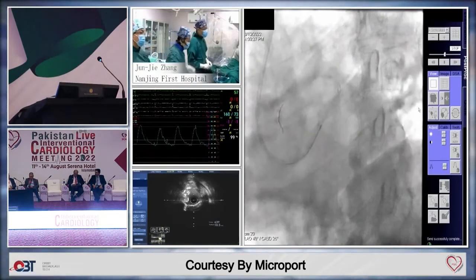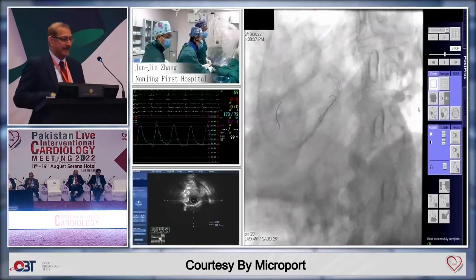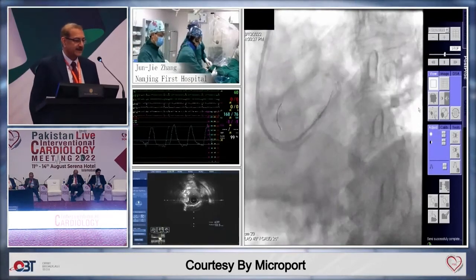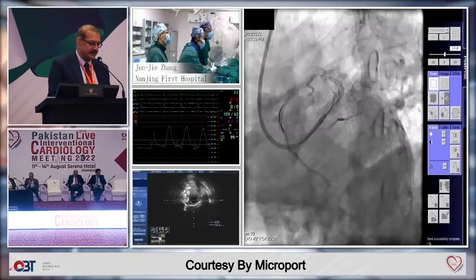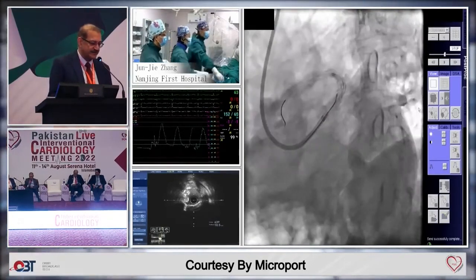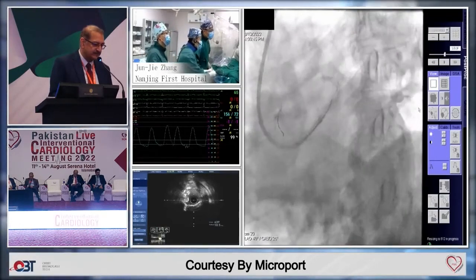I will do the final step. I will do the final rewire. Anyway, before we rewire, we do the angio again. Okay. Ideally you should have 10 minutes because we started late by 10 minutes, but just to be comfortable, show what best you can to us.